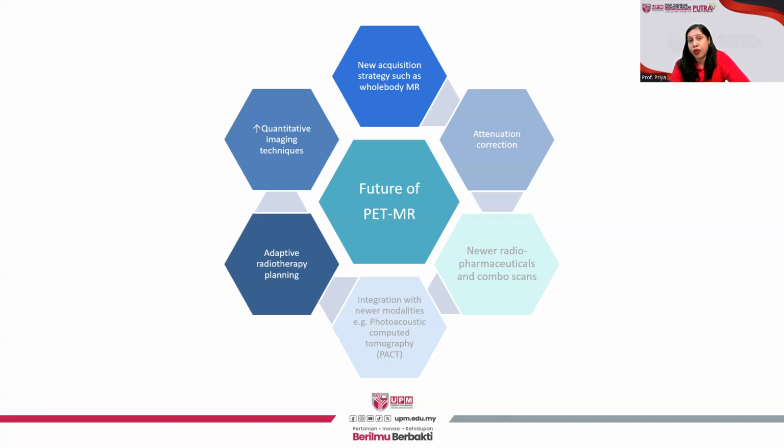And we are looking at future integration with even newer modalities such as photoacoustic computed tomography or PACT, which may be the newer generation of scanners which incorporate even less ionizing radiation using photoacoustic technology. Therefore, we can see in the coming decades marked improvement in technological advancement for hybrid modalities.